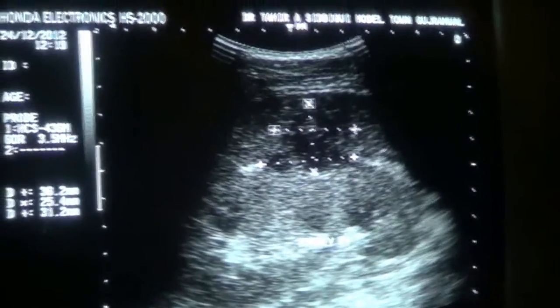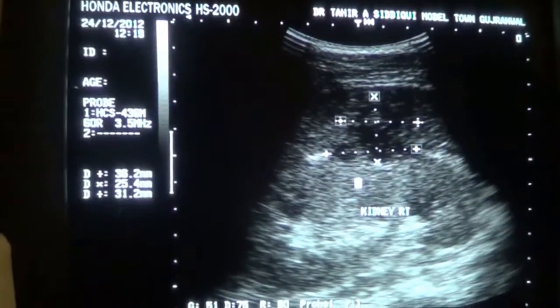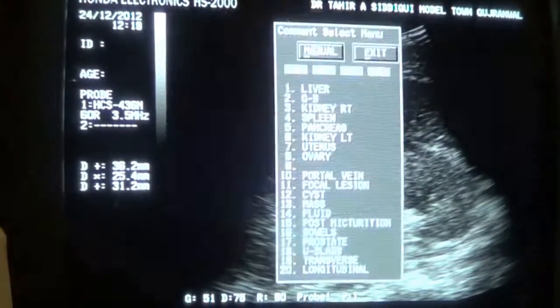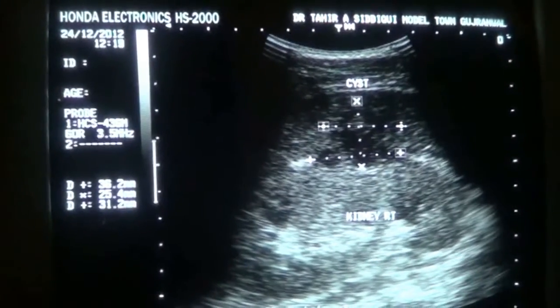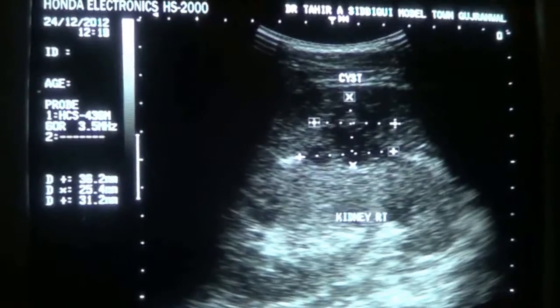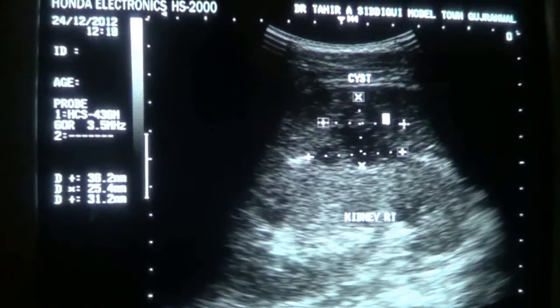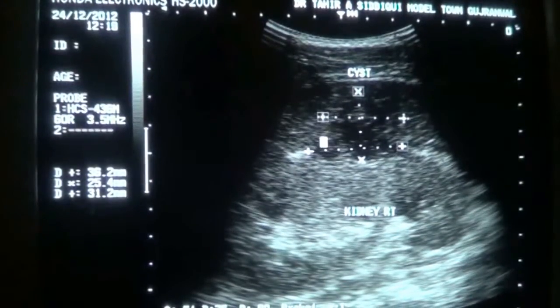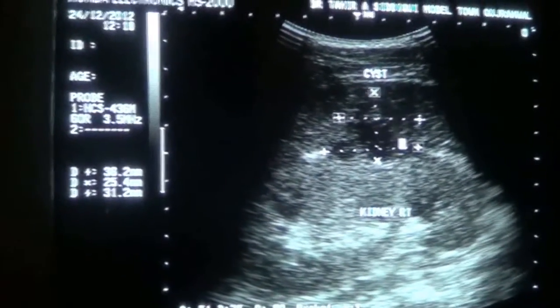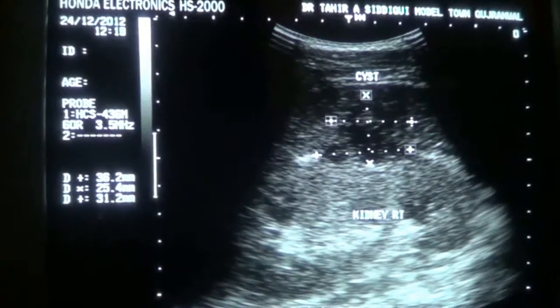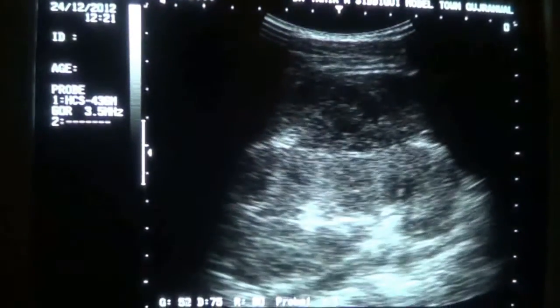This is the right kidney. This is the upper pole of the right kidney and this is the lower pole. This area, which I am going to label as a cyst, shows a breach in the anterior mid capsule of the right kidney, approximately measuring 31 by 25 mm, as an irregularly outlined cystic area with internal echoes seen in this region. This is a case of acute focal pyelonephritis or lobar nephronia.